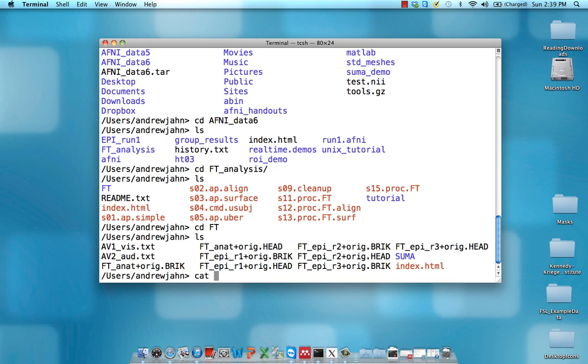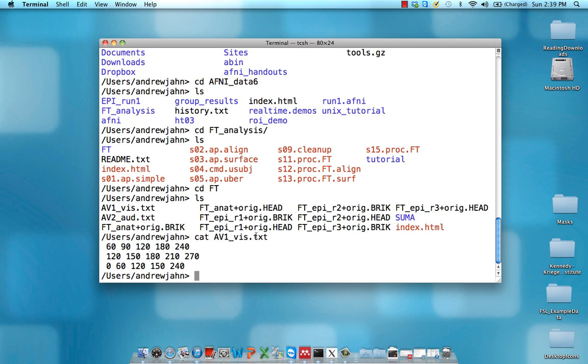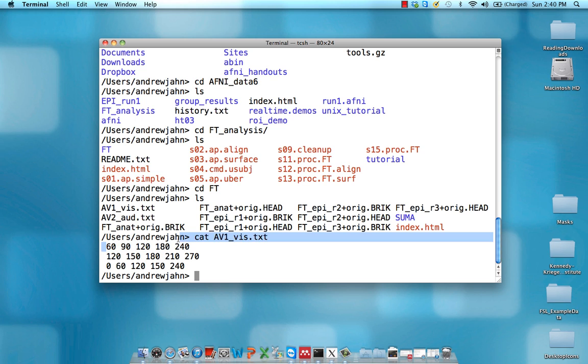We're going to type cat for concatenate and av1_vis just to see what's in there. So the way to read this, there are a couple different ways you can have timing files in AFNI. This is one of the formats. In this case, we have three rows, and this first row shows at what time in seconds the visual stimuli were presented.